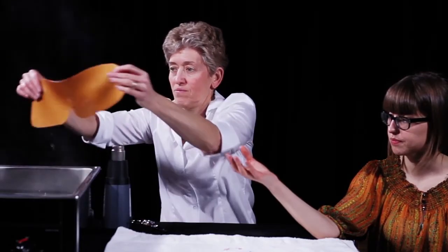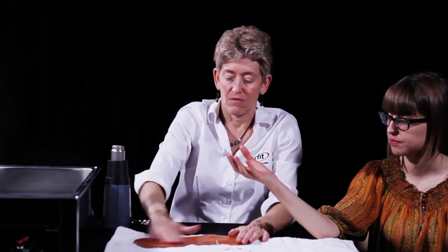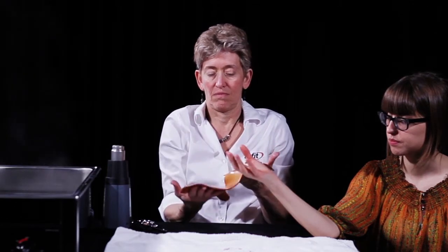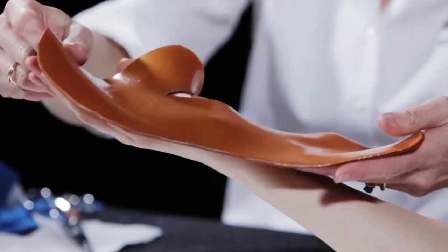Remove the heated orthosis from the water bath with two hands and dry briefly on a towel to remove excess hot water. The patient's hand is positioned with the forearm supinated and the elbow supported on the table. The thumb and fingers remain in as relaxed a position as possible.